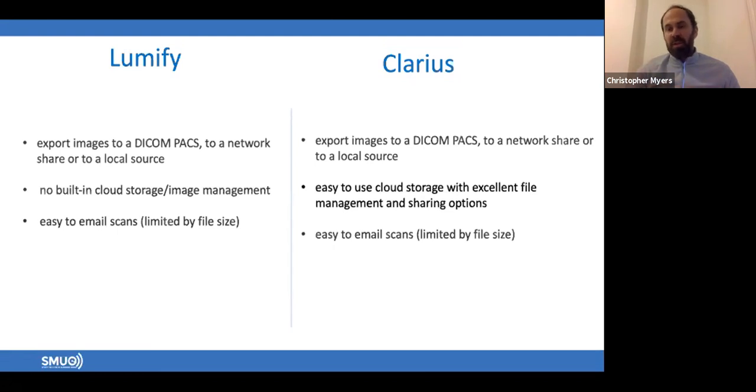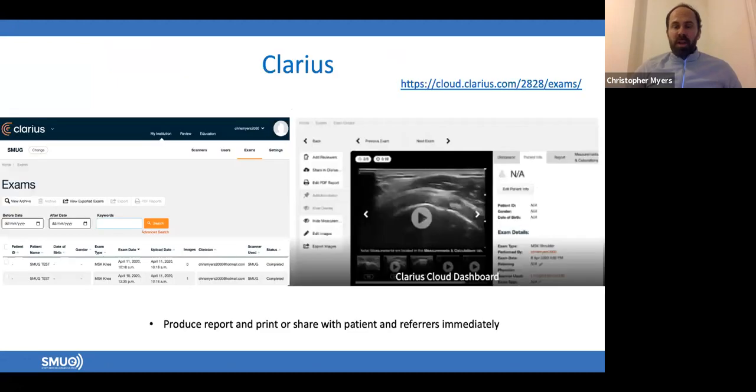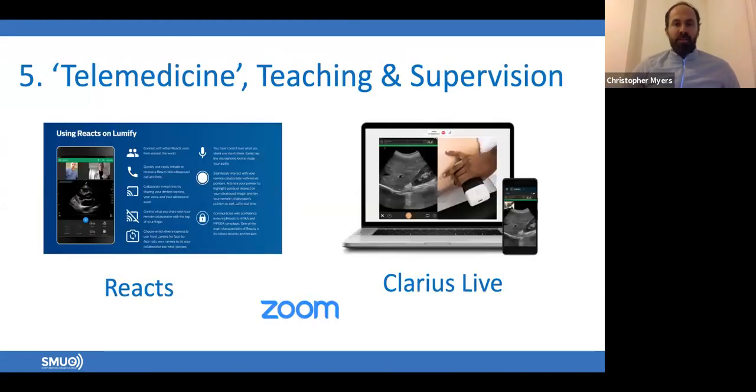And also if you're doing some sort of logbook, then you can share with your supervisor, they can make comments. So this is excellent. This is really good. And as I said, this is not just good for a handheld machine. Hopefully, because I don't know of any other laptop machine or cart-based machine that has this cloud system. And hopefully this is something that many of them will follow. So that's a really interesting area and a really nice way of sharing your scans.